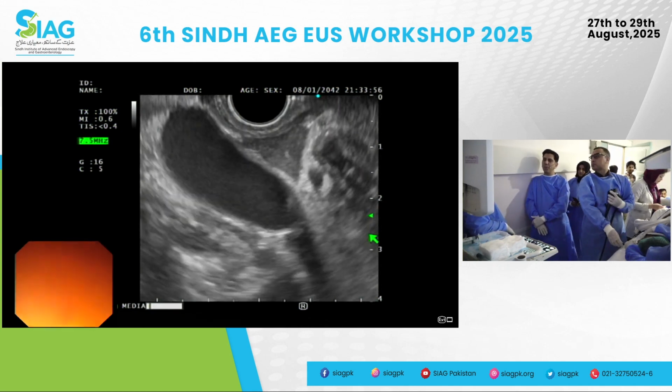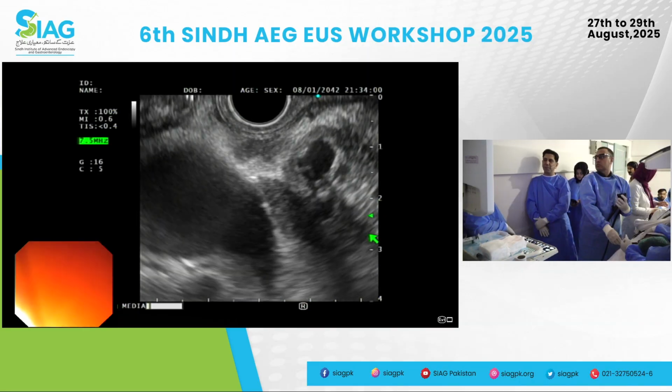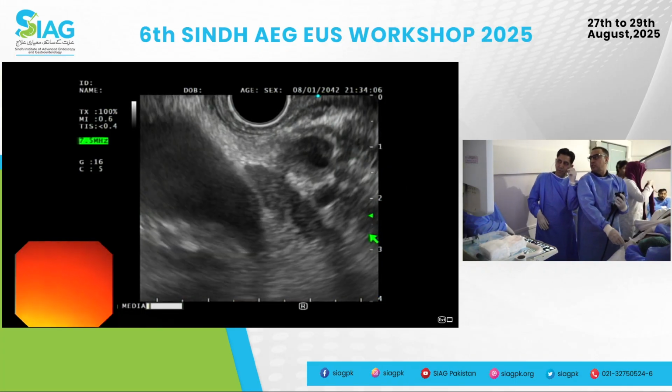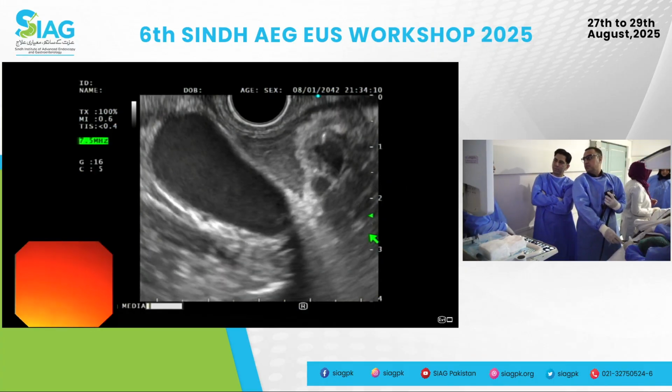And what we have found is different from what was initially presented to us. So let's see if we can demonstrate, Shah Yusuf. And do you want to talk us through? Yeah. So we can see that there is a stent in the CBD toward the right of the system.